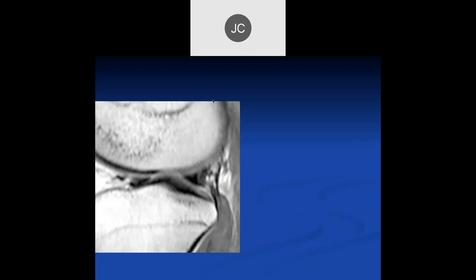Jason, remember, we're talking about peripheral tears of the menisci here. What do you think is going on here? I think that the posterior horn of the lateral meniscus looks intact, and there's a ligament of Wrisberg adjacent. So what do you think this is then? Is that just the recess between the two? Okay, so you're calling this the ligament of Wrisberg?